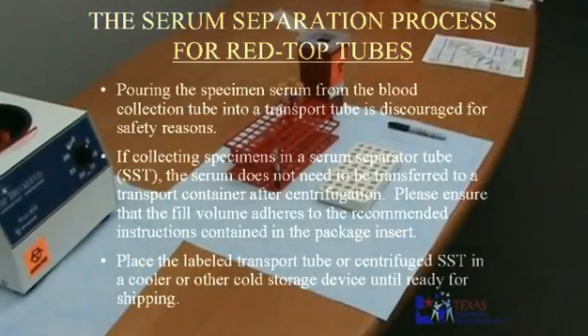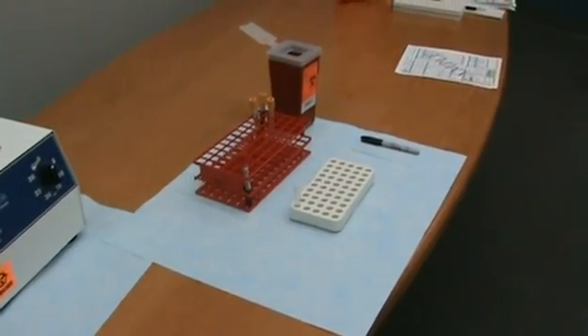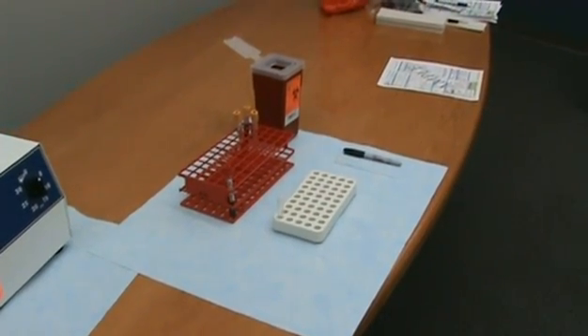Assemble the required materials needed to perform the serum separation: test tube rack, transport container, transfer pipette, absorbent pad, permanent marker, biohazard container, and PPE.